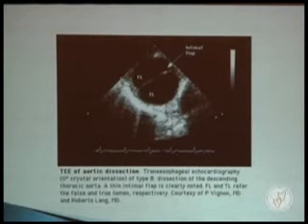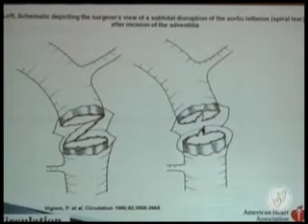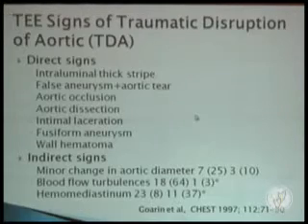So it's extremely important to do TEE in these patients and diagnose the dissection here. Whereas these patients are so unstable with hypotension, shock, CT angiogram and MRI may not be practicable. So TEE is very, very useful. Diagrammatically, this study by Vignon shows a spiral dissection all the way around, subadventitial. The adventitia is the only thing holding the high pressure inside the aorta intact. And once it ruptures, there's a torrential hemorrhage and the patient dies.